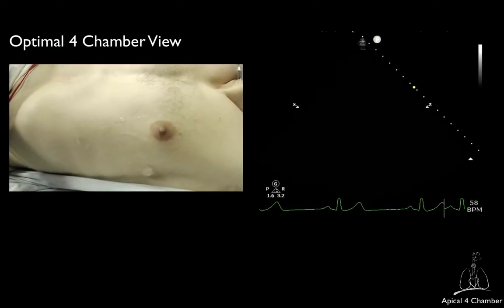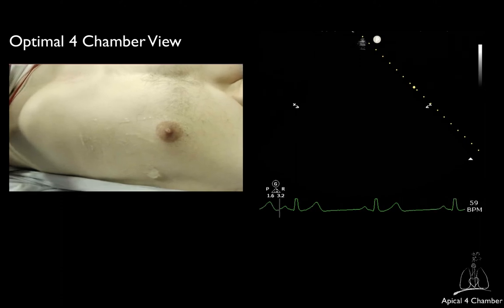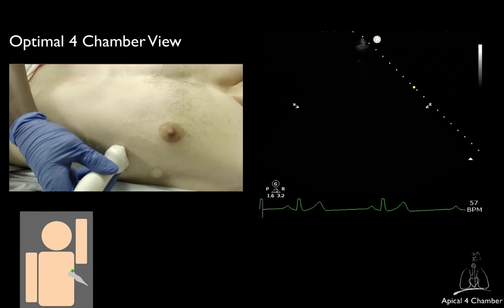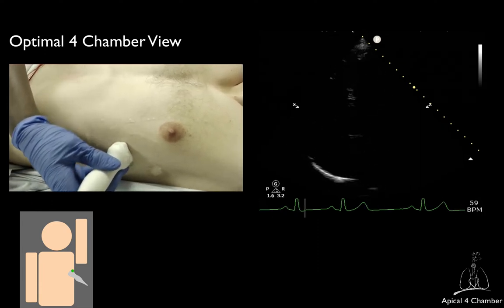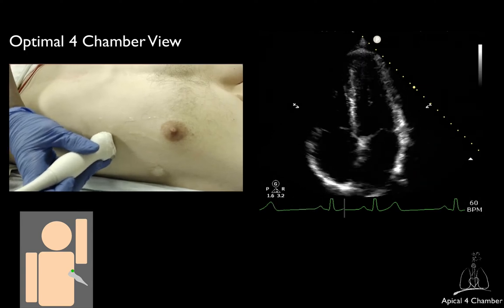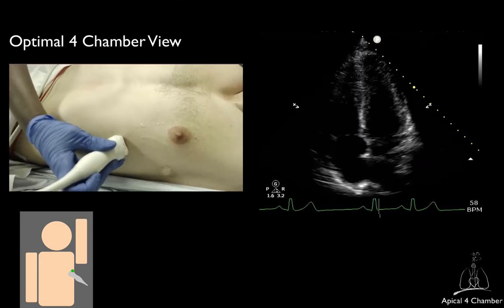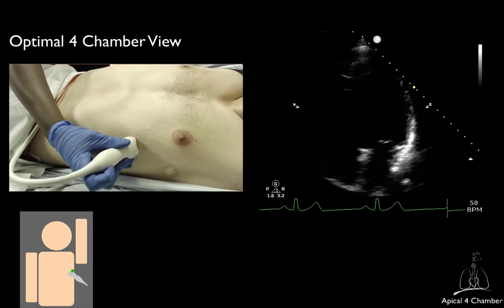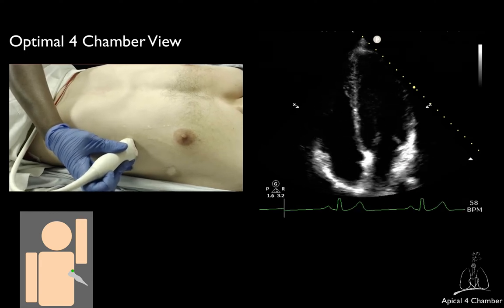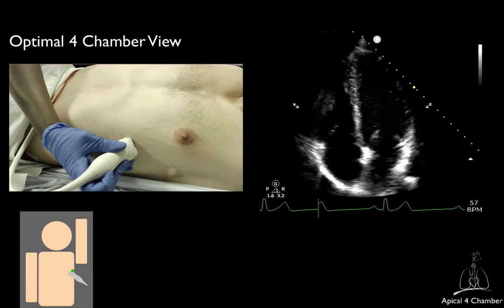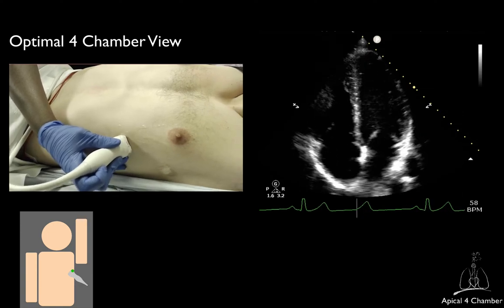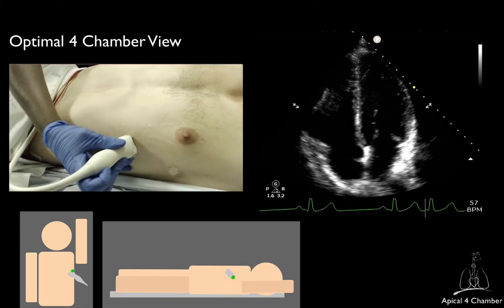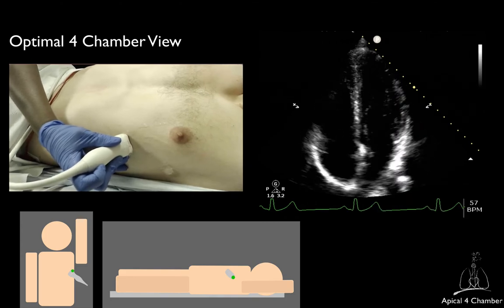The apical 4-chamber view is usually found near the point of maximum impulse. Most of the time, the transducer will be positioned between the 4th and 6th intercostal spaces, between the midclavicular and midaxillary lines. In the vast majority of patients, this point will be below and lateral to the left nipple. The location of the optimal acoustic window varies significantly with the patient's position; for example, in supine patients, the optimal apical window will be significantly more medial. The transducer marker should be pointing towards the patient's left with a slight counterclockwise rotation, approximately between 2 and 3 o'clock.